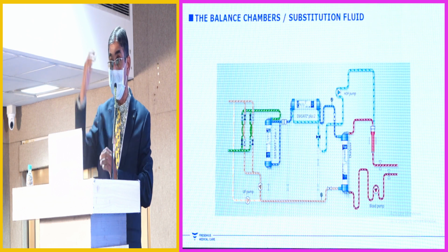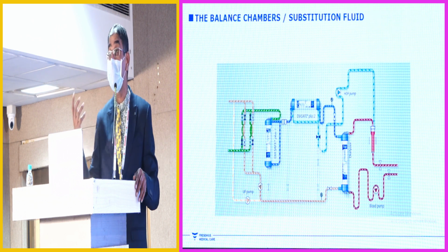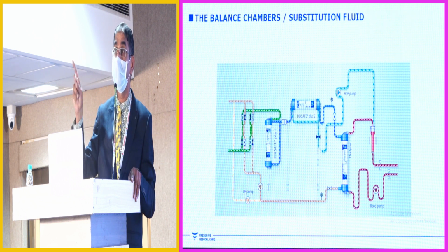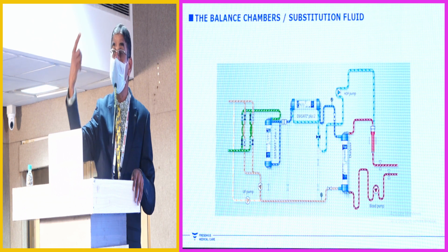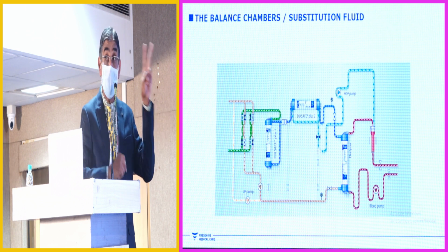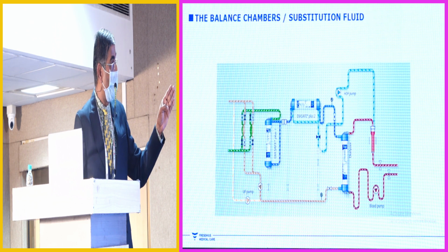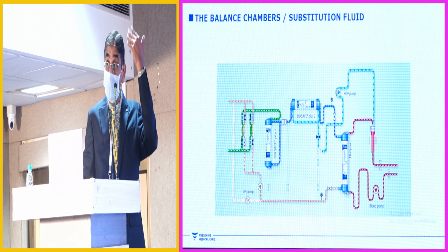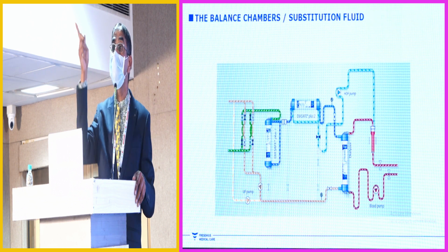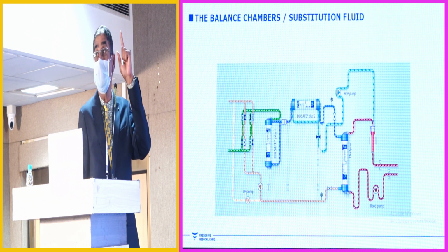The acid is one part, probably 34 parts of RO water if it's your normal hemodialysis machine. But if you're using a dry bicarbonate, it is 32.775 RO water, and then the bicarbonate will be 1.225. All this is mixed. It goes into a degassing pump. Of course, it will deaerate, and then it goes through the 2 endotoxin retention capacity filter. The first one, it will pass through, and what comes out through the pores will again go through the second endotoxin filter, and what comes through the fibers will definitely go to your dialysate compartment. That means it has already double filtered going to the dialysate compartment of the patient.